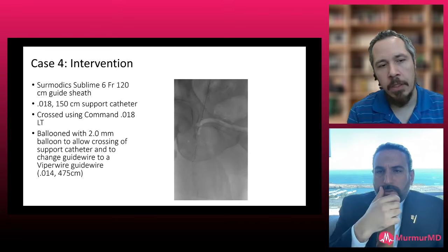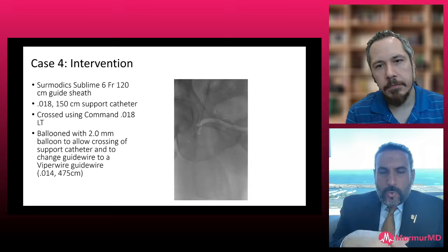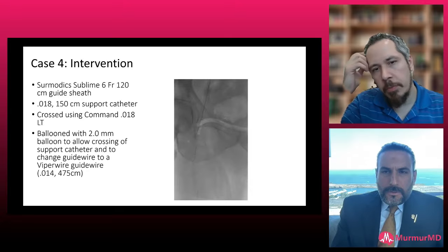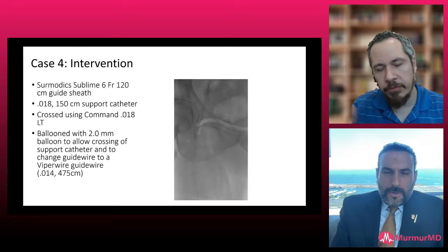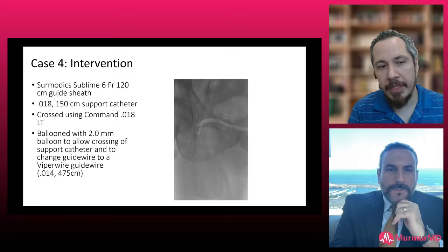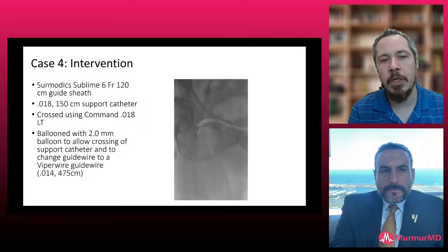Now, Sam, let me ask you a question. Since you got the imaging CT, did you know whether the SFA and distal were open, or were you going into a blind segment? The SFA is open. The SFA was open and no disease all the way through to the foot. Okay, great, good runoff. Yeah. So we had the radial prepped, we had the pedal prepped when we went in, because I think that's what you're alluding to, figuring out which pathway I need to get through.